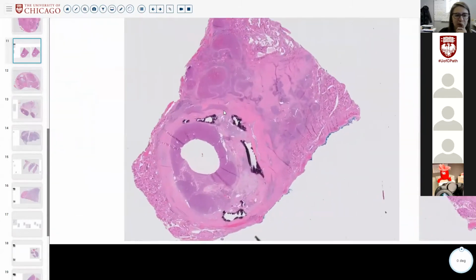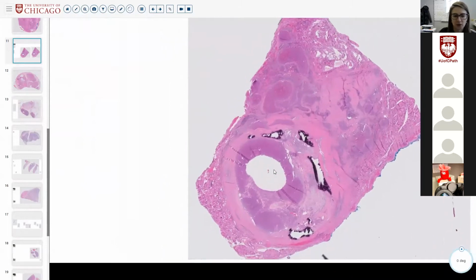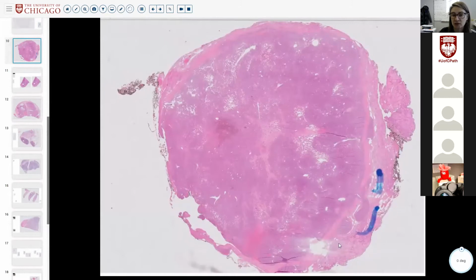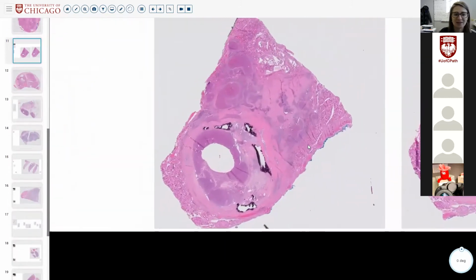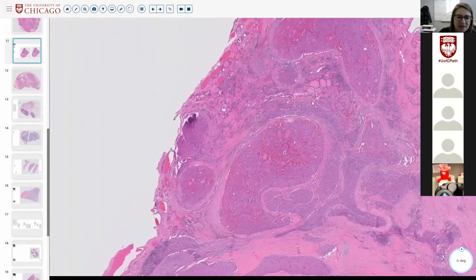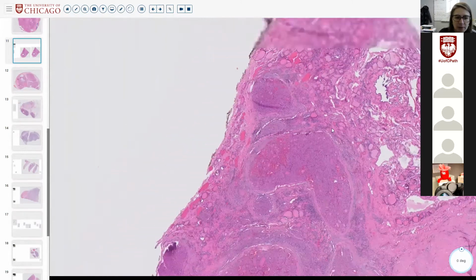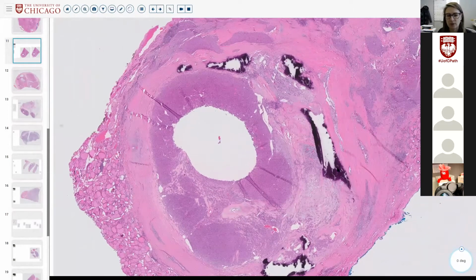Here's just another example of a diffusely infiltrative Hürthle cell carcinoma, that I wanted to show you the difference. Sometimes you're dealing with a nodule like this, where you have to look very carefully at the capsule. And sometimes you're dealing with something like this, that just on low power already looks like it's blowing through the thyroid, right? So there are multiple nests. These nests have intervening normal between them, right? So probably your epicenter was this, and you have totally invaded through the capsule.